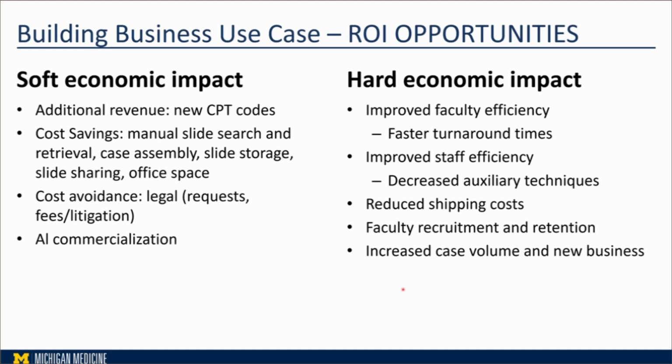Maybe you can take it out of this workflow, and one of the things is that the faculty and trainee can review those cases at the same time. Improved efficiency, same thing, reduced shipping costs. Faculty recruitment and retention, for example, working from home. Right now we have a really successful rate with residency recruitment because everyone is excited to go to a department that's already digitized. And of course, increased case volume for new revenues or new businesses.